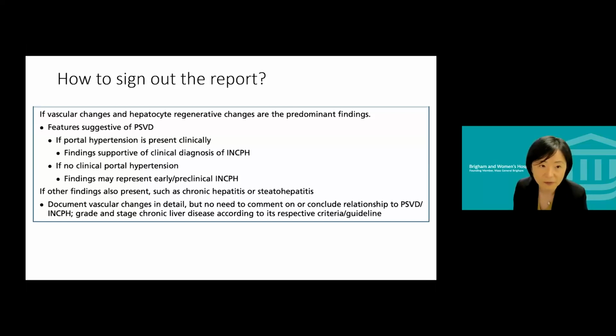And if clinically there is portal hypertension, then we would comment that the findings are supportive of the clinical diagnosis, idiopathic non-cirrhotic portal hypertension. If there is no clinical portal hypertension, then we'll say in the comments that the findings may represent early or preclinical idiopathic non-cirrhotic portal hypertension.